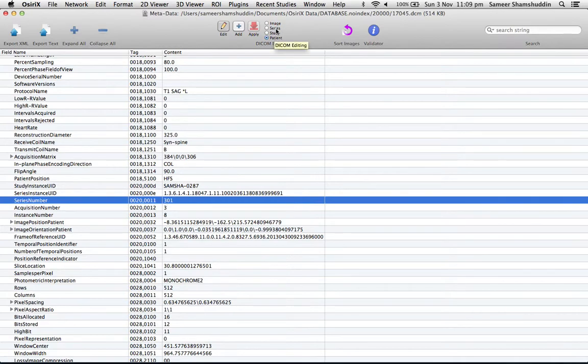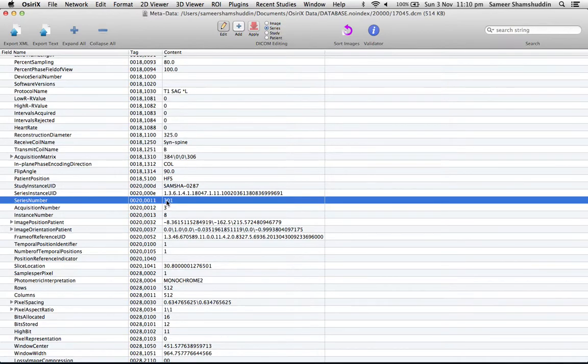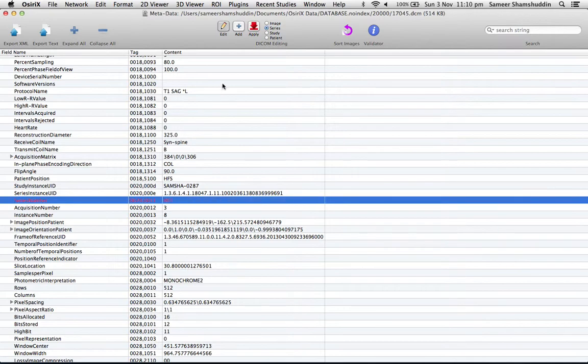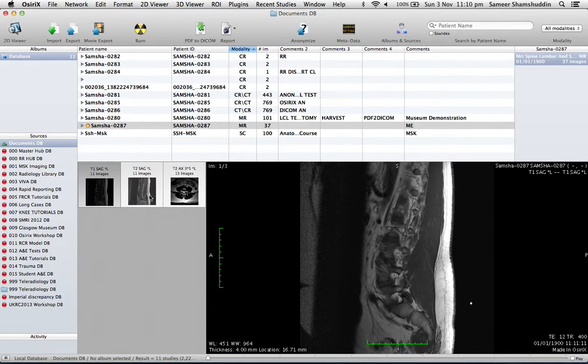So we need to edit this. Click Edit and change this to that particular series. Make sure it's selected to Series. By double-clicking on 301, I can get rid of that and make it 001 instead, and click Apply. So now I have my T1 sagittal first, T2 sagittal second, and T2 axial as third.